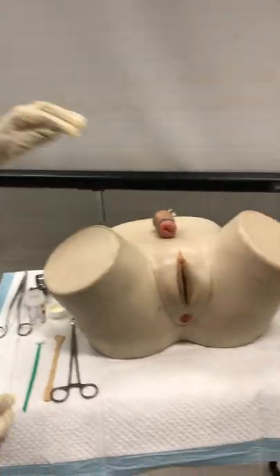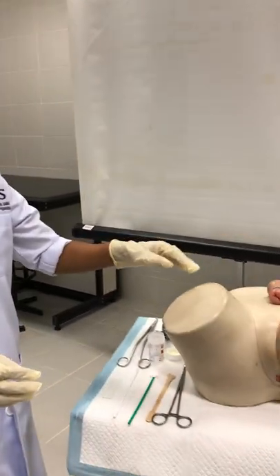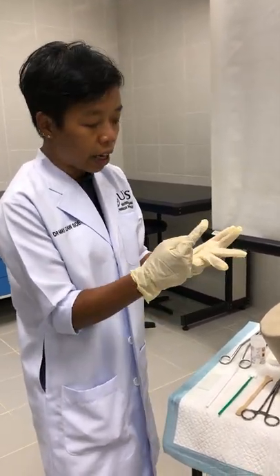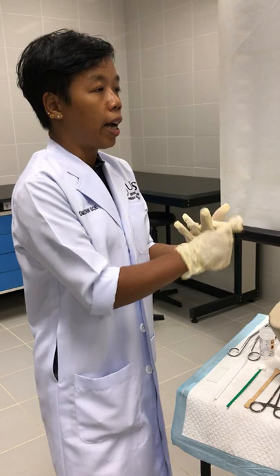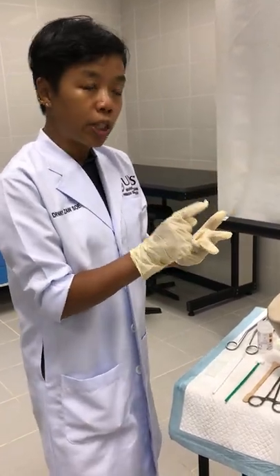This is a mannequin, but before you take the pap smear from the patient, you must explain to the patient the benefit of the pap smear, the indication, and the complication, which is very minimal. This helps you get the patient's consent.